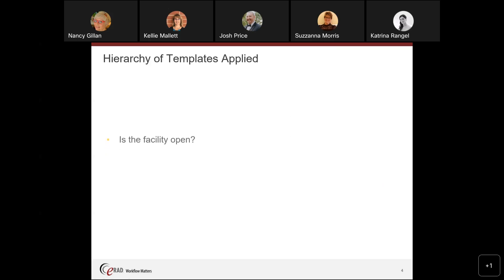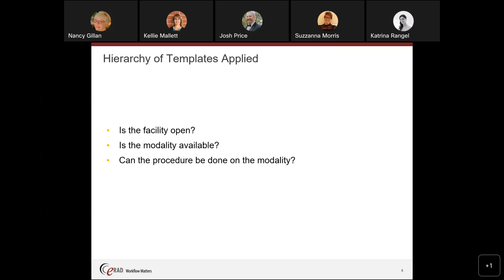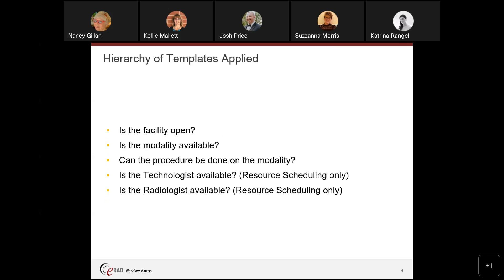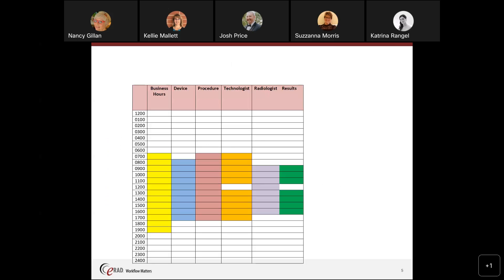The hierarchy of the templates is: Is the facility open? Is the modality available? Can the procedure be done on that modality? Is the tech available with resource scheduling? And is the radiologist available with resource scheduling? Business hours should always be the longest amount open. The device may have different hours. The procedure itself may be done during certain hours. The tech may be available only certain hours — for example, there's a block for lunch. The radiologist doesn't come in until 9 and only works until 5. So these constraints together define the available time slots.